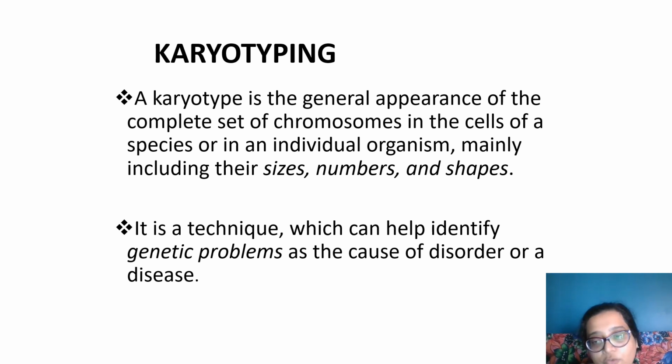But the AI tools cannot replace the cytogeneticist or the morphologist. And I am lucky enough to have been trained for a month in this technique in Spain, and I have seen both the previous method of doing it under a microscope, and I have used the software, and I've learned from the best. I was under one of the most experienced cytogeneticists that I've ever met, Dr. Granada, and she was a wonderful person and gave me a rich hands-on experience for this technique.